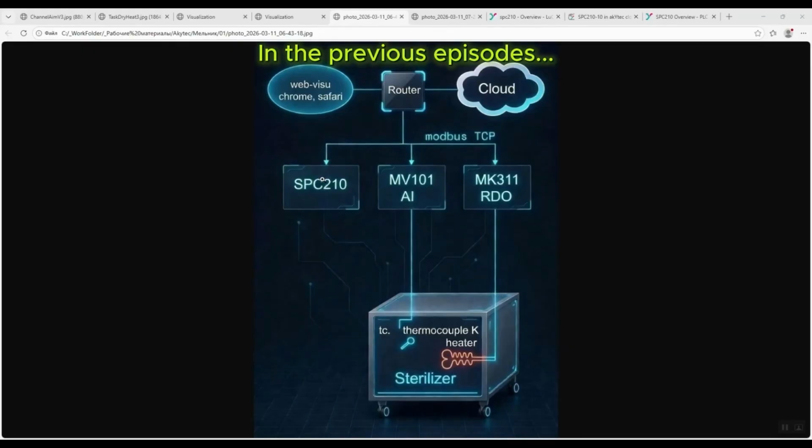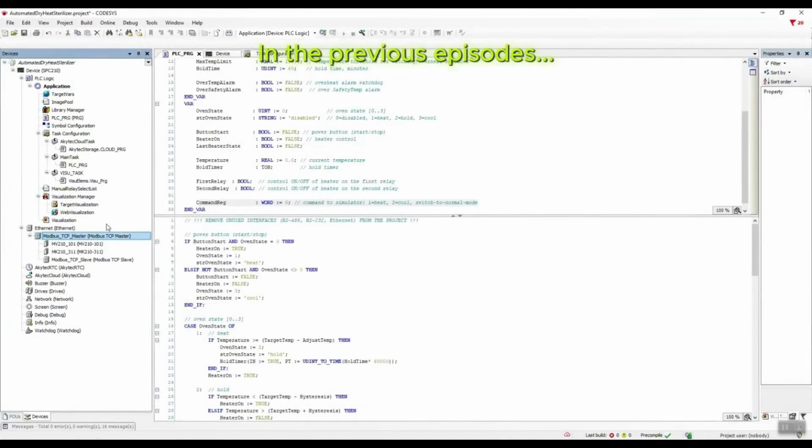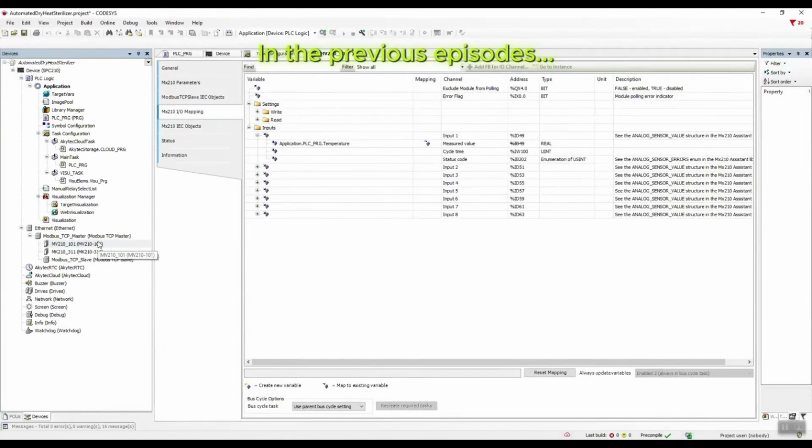akYtec cloud service. This template developed by akYtec frees the user from needing to know what Modbus is. That is, you don't have to spend time studying documentation, the module's register map, or worry about how to properly configure numerous parameters for forming requests, or rearrange registers to get correct data and convert them to the required types.